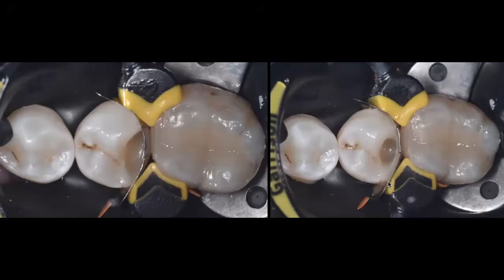And again, I start now playing with a little brush, an artist brush that I use, a very small one, and a little bit of adhesive, and just kind of pushing this layer towards the band, towards the buccal, towards the lingual, and towards the gingival floor. Again, my goal is to get beautiful adaptation of this.